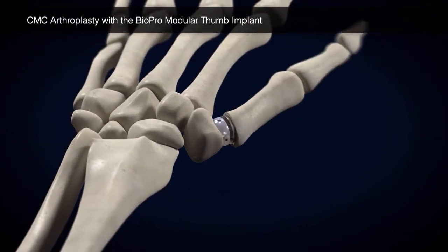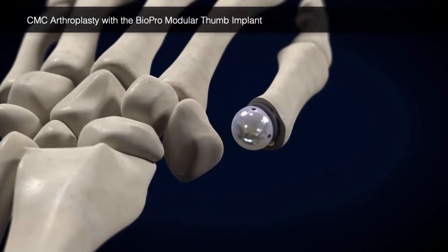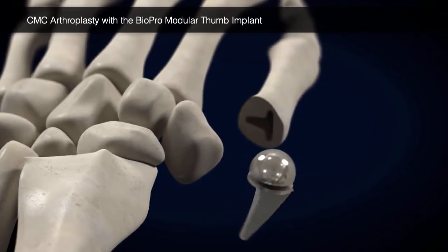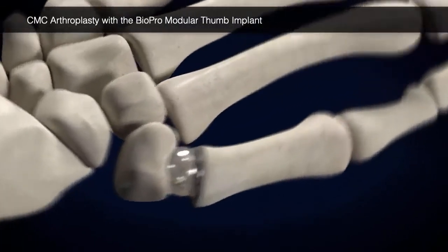Observe range of motion and joint tension. Remove the trial implant and replace with the final implant, impacting the stem flush with the metacarpal base. Again, range of motion and joint tension should be observed.